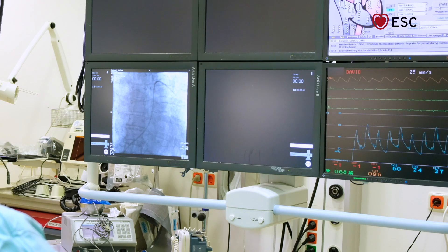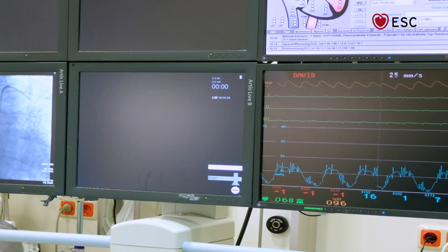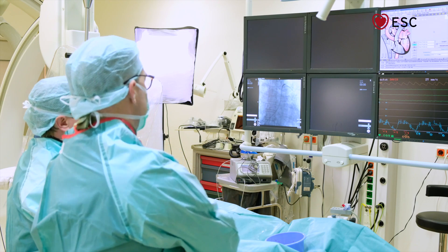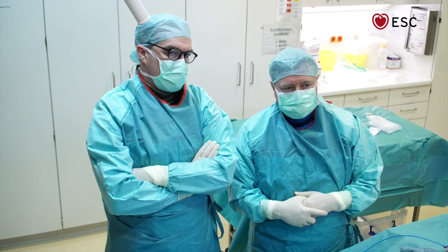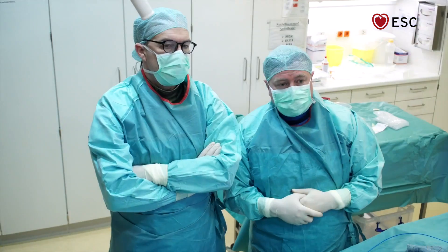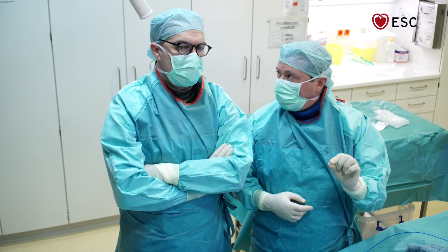We now have a pulmonary artery pressure curve. We are in the wedge position and we see the wedge pressure, which goes up and down in accordance with intrathoracic pressure. On inspiration, pressure drops because of negative intrathoracic pressure; the reverse happens on expiration. Ideally, you look at the stable end-expiratory phase as the true reflection of wedge pressure. It is a good quality signal if you see these respiratory variations, but we should read the pressure at the end of normal expiration.